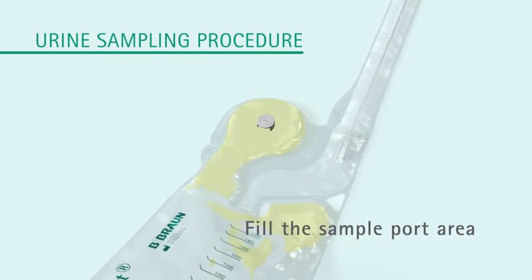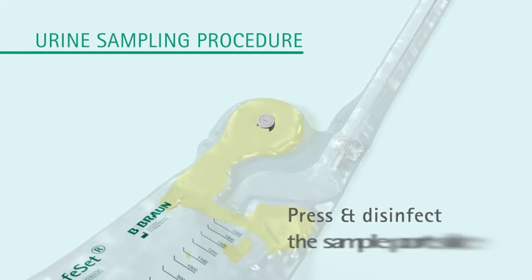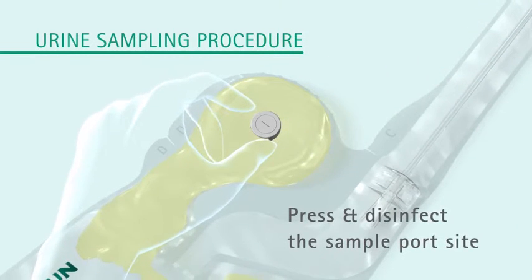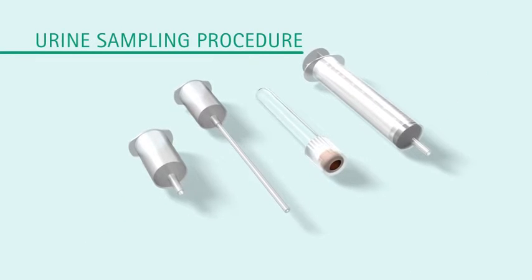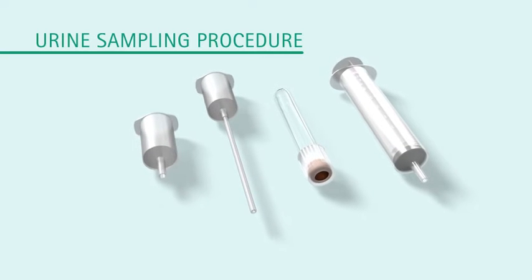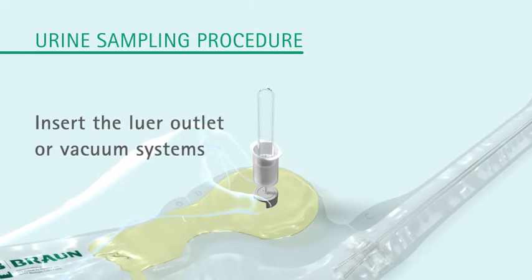Bring the urine into the top of the pouch to fill the urine sample port area. Press on the sample port to avoid air bubbles underneath. Disinfect the sample port before taking the urine sample. Actrine Safe Set sample port is compatible with lure outlets and vacuum systems. Insert the outlet and proceed to sample according to the device.